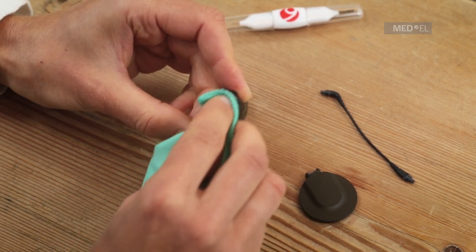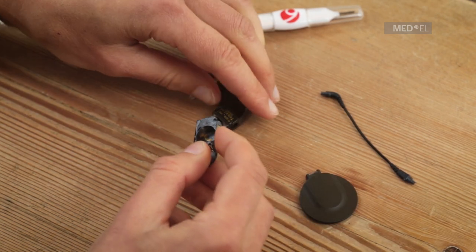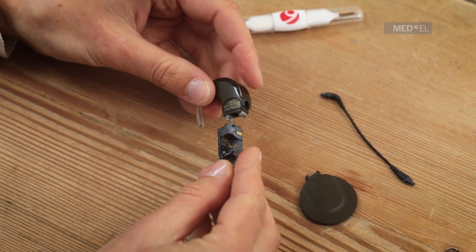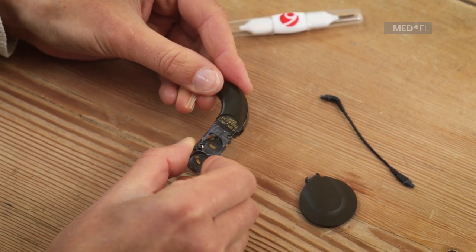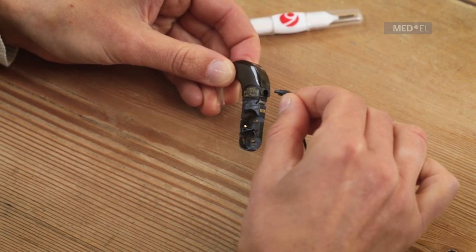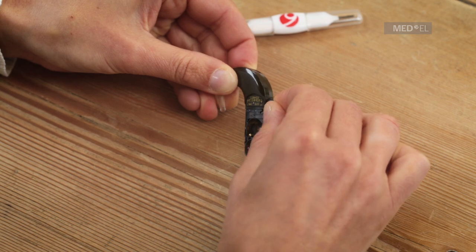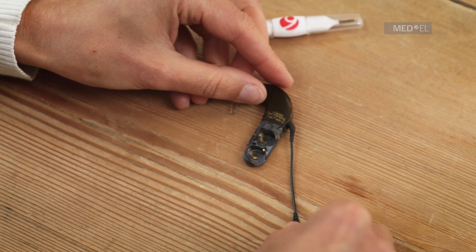If you don't see any signs of damage, however, you can reassemble your audio processor. First, attach the battery pack frame to the control unit and note the mechanism that secures the control unit to the frame. Then plug the coil cable into the control unit, and note the correct orientation of the coil cable socket. Connect the coil cable to the DL coil.